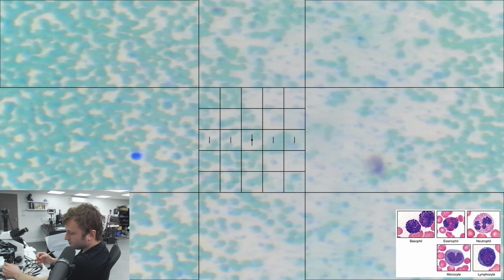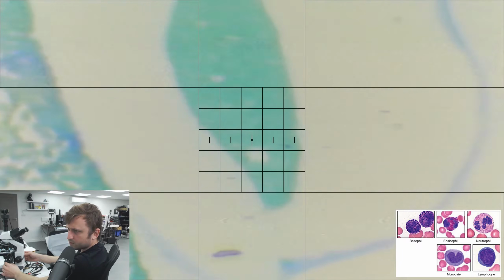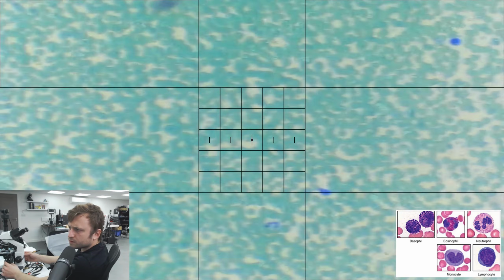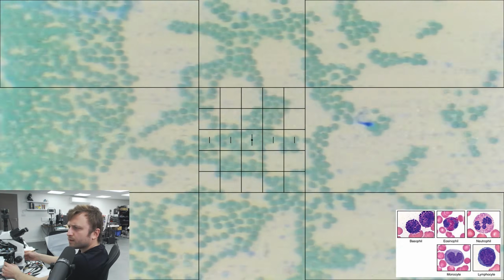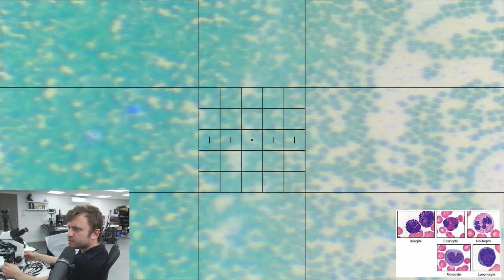Neutrophil, lymphocyte, 75, proceeding, lymphocyte, more material out here. Okay, scanning, neutrophil, unknown, I won't count that. So neutrophil, unknown, going to count that as debris. Next row, neutrophil, lymphocyte, debris.